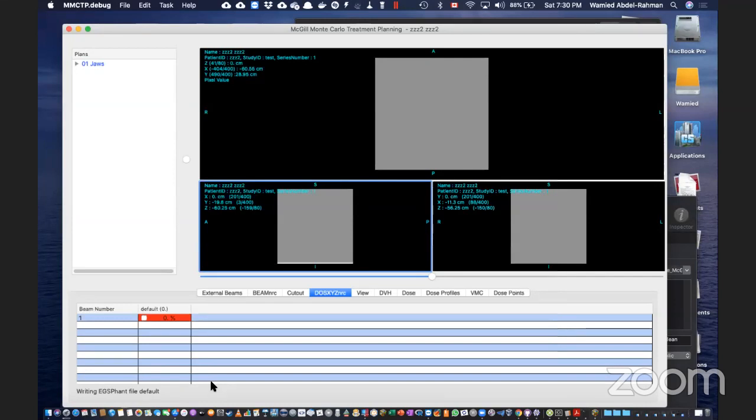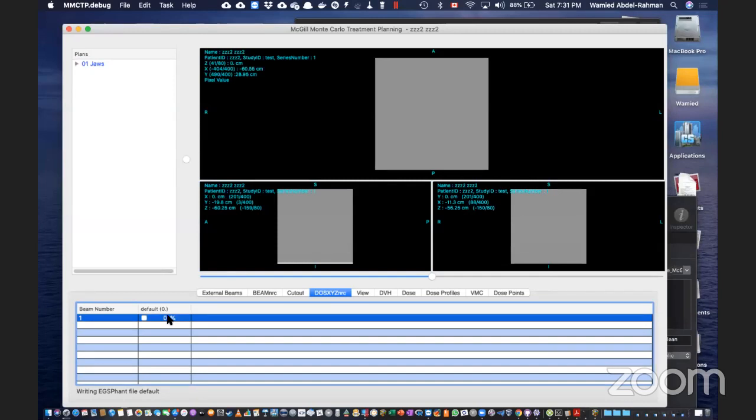Right, so let me chime in. Because Omid is using a CT to density conversion, every single one of those voxels has to go through a conversion. So it's very slow. The higher the number of voxels, the more processes take place to determine the Hounsfield unit for that voxel, and then to apply that Hounsfield unit through a mathematical conversion to a material and density. That's why it was taking so long. By the way, you create this phantom only once, so if you want to go with this high resolution phantom, it's still not a problem.